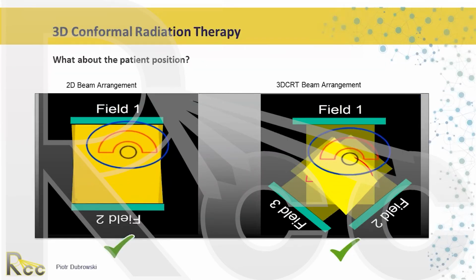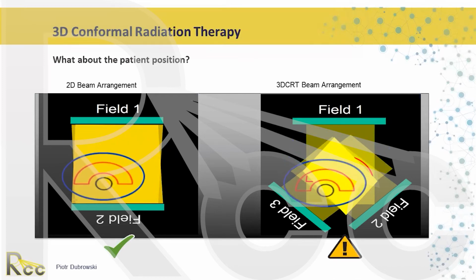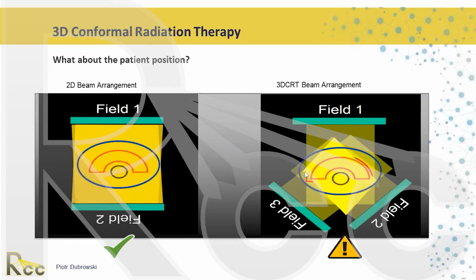So again, this just kind of shows you how the patient being moved, you could see the beams, and moving moves different areas in or out. So you'll get like a cold spot if the patient's too far to the left or to the right, versus with an APPA field, you're pretty much going to hit everything you need to a degree.